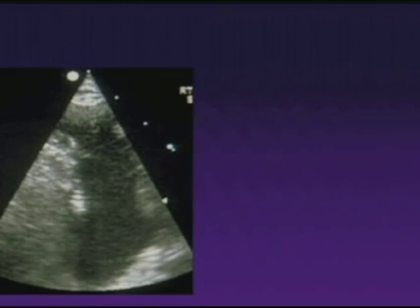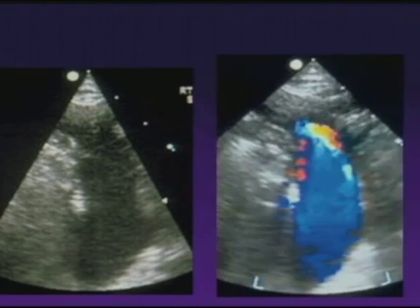Echoes inside the veins are extremely common. We want to look at the echoes inside the vein and see if they are fixed in position, which would indicate fixed filling defects like a thrombus, or whether they are moving through the field, such as happens in rouleau, where the slow-moving flow moves through in one direction, or whether this simply represents noise from beam width artifact. And here, as we can identify in our color, the vein fills in completely, indicating that this is just normal noise in this particular patient.